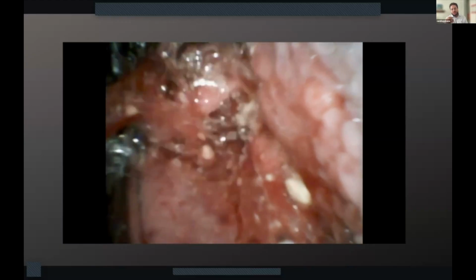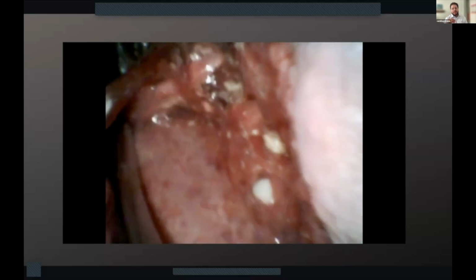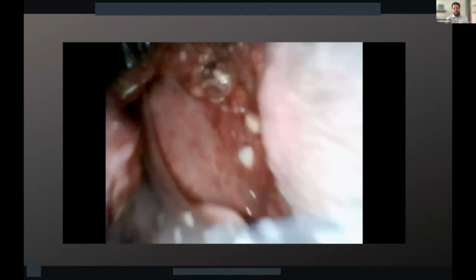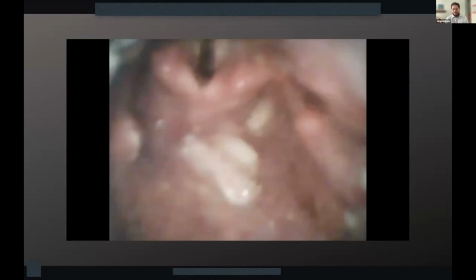And so as you can see, the tube is a little posterior, and actually we miss our intubation in this case. We deliver into the esophagus. We unfortunately miss our exit here. But we come back in, and the clinical team must have noticed that they intubated the esophagus. And this time we get a better view.